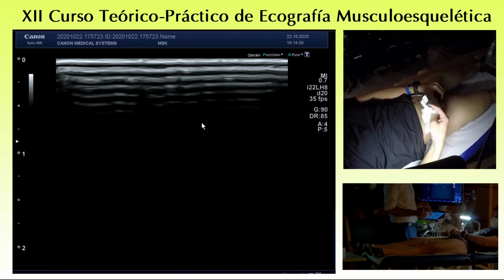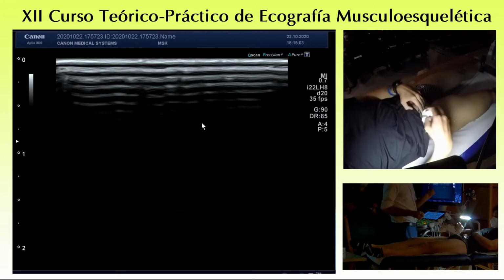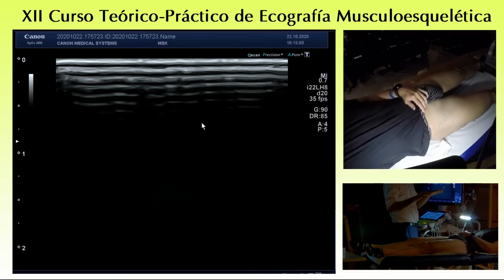Yeah, well, not personally, but with the anesthesiologist, very often for the herniorrhaphy they perform the block, and the spot where they aim is the interface between the transversus and obliquus internus. This is your main landmark. Okay, main landmark to perform the block.